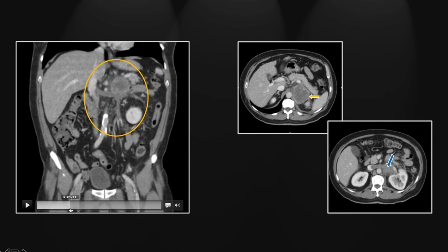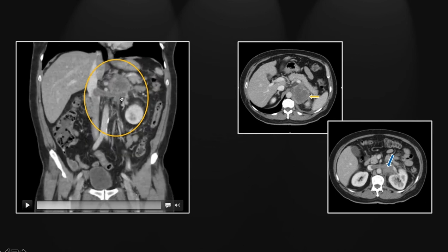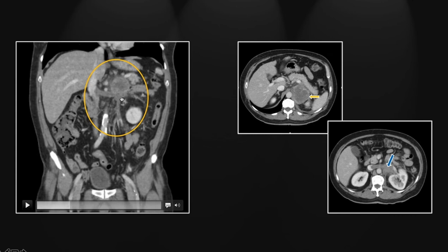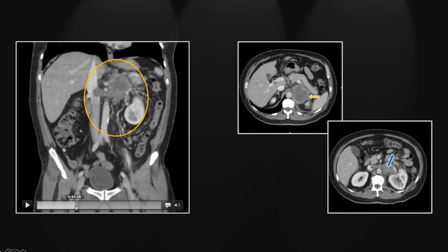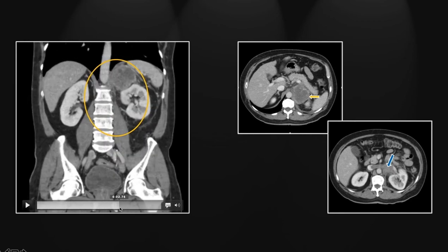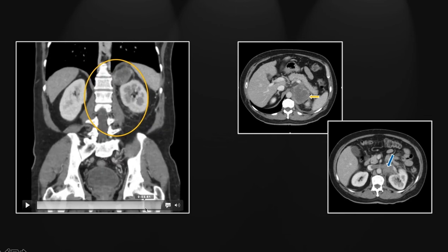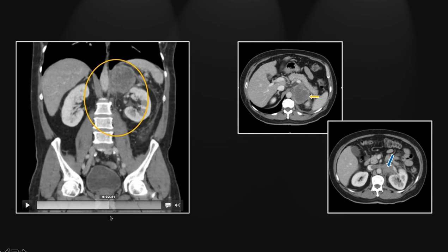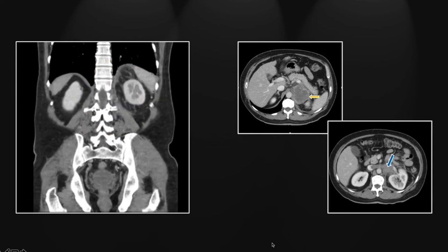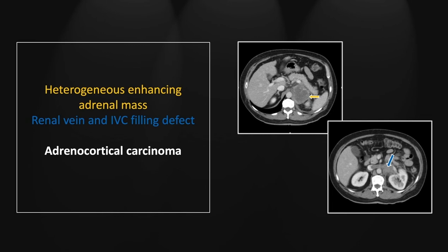On the coronal view, you see that large adrenal mass with a hypodense enhancing filling defect involving the left renal vein. Just inferior to that, right here in the proximal segment of the left ovarian vein, you can see additional angioinvasive tumor including that proximal portion of the vessel. Going more posteriorly, you can appreciate the preservation of the interface between the adrenal gland and the superior left renal pole. So that is a case of an angioinvasive adrenocortical carcinoma.